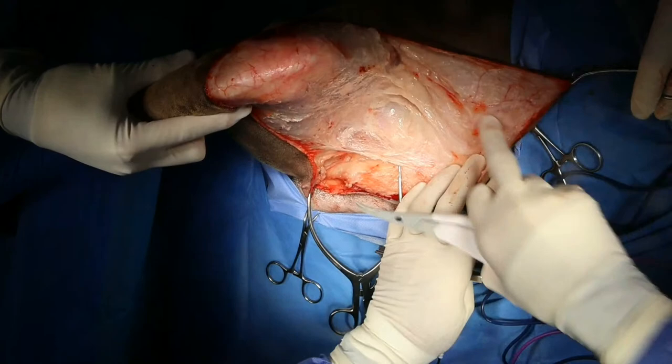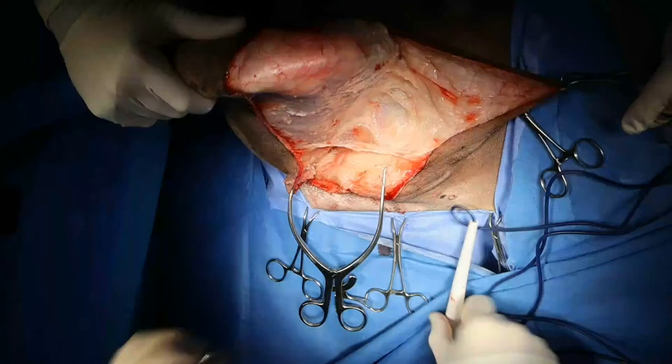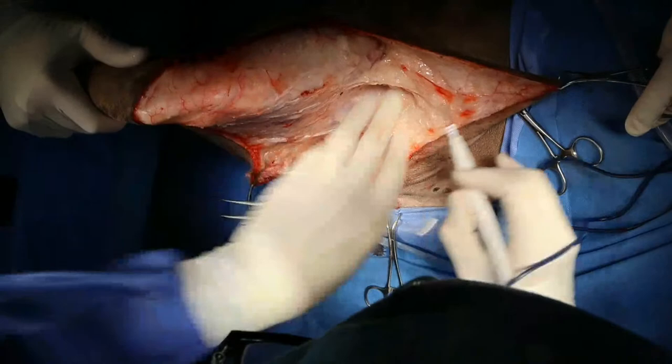Yeah, so there's the robust blood supply to the flank fold flap. And fat, which is what we're cauterizing through now, does not conduct electricity very well. So very fatty tissue can be hard to cut with cautery.